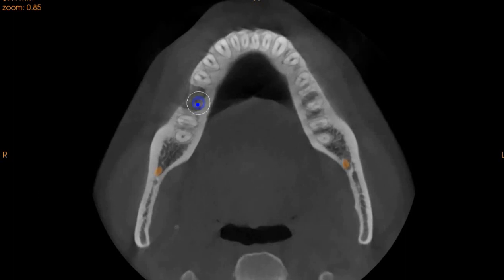We can even narrow the implant and take it to 4.8 millimeters. But 4.8 and 6.0, both implants will be sufficient for placement in the lower right ridge.